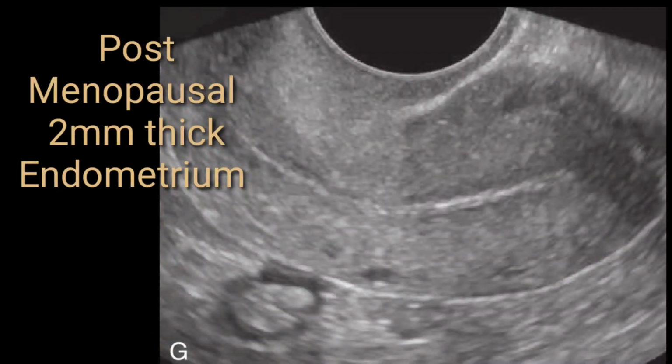Here on this transvaginal scan, you can see a clearly well defined uterus. This uterus is retroverted and retroflexed as well, and this is a postmenopausal patient. Although the uterine myometrium is okay, with no certain atrophic changes, you should still take the endometrial measurement. Endometrial measurement in postmenopausal ladies is very important. It depicts certain pathology, and it is also very important to look for endometrial carcinoma.